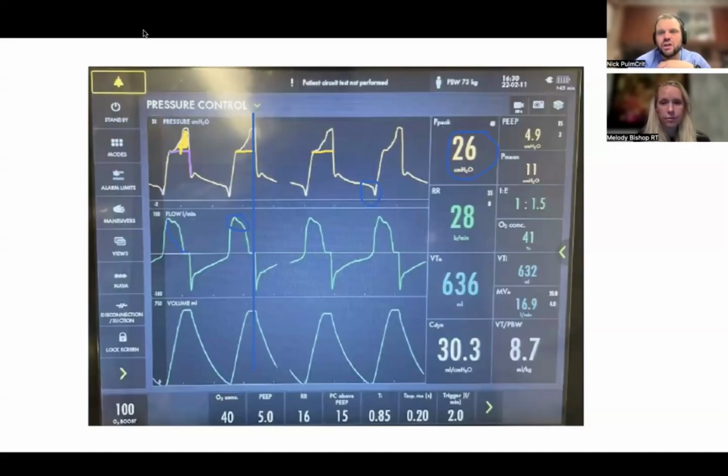He looks the best on that, but just be aware. And certainly, to the point earlier, that's probably where you want your alarms much tighter, right? So the vent might be dinging more, which gets everyone in a tizzy. But it's important to have the vent let you know there's an issue, you should look at it. So it's not a set-it-and-forget-it thing. You really need to be cognizant of what's happening when you leave someone on pressure support. But sometimes it's better for the patient, and they don't feel like they're struggling the whole time. So I agree with you. Okay, well, with that, shall we end it for now?